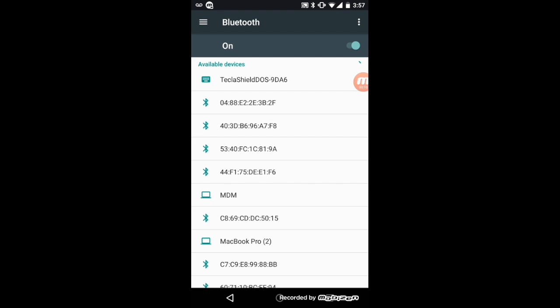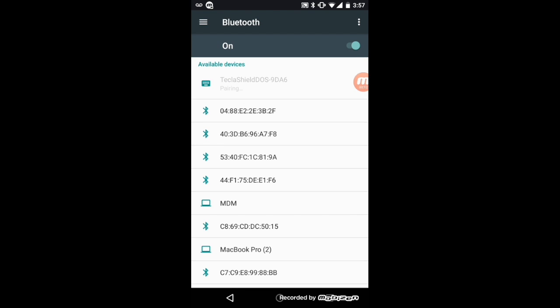Once it is found, you will see the Tecla Shield listed on your screen as Tecla Shield DOS, followed by a few random numbers. Click on that label.